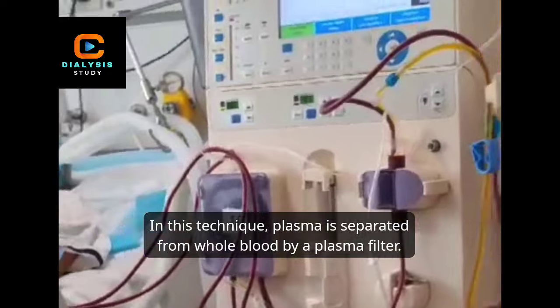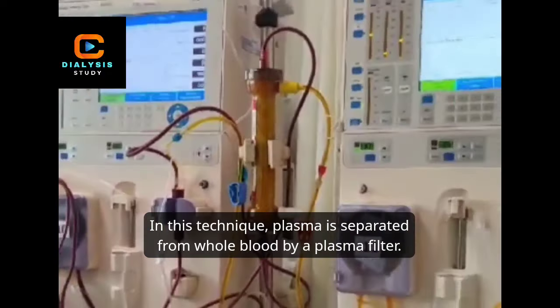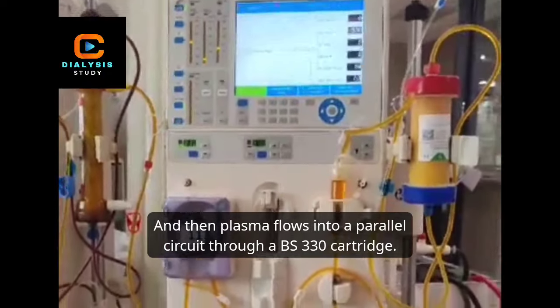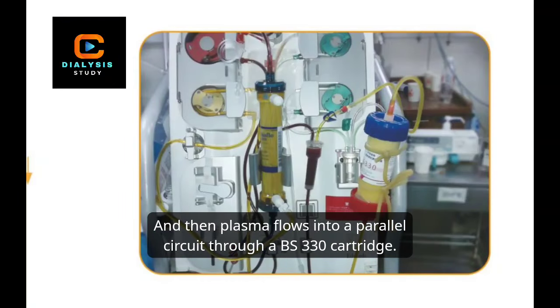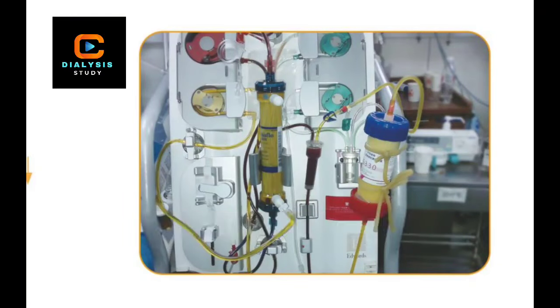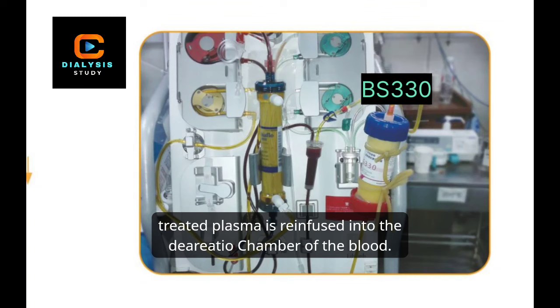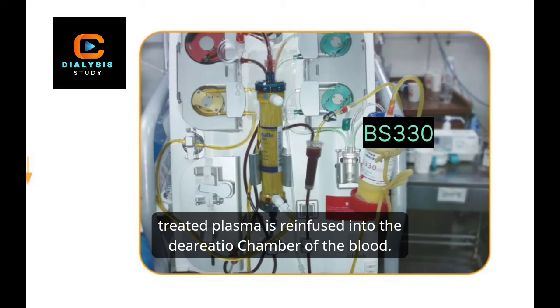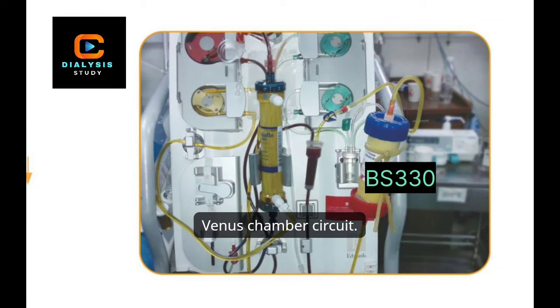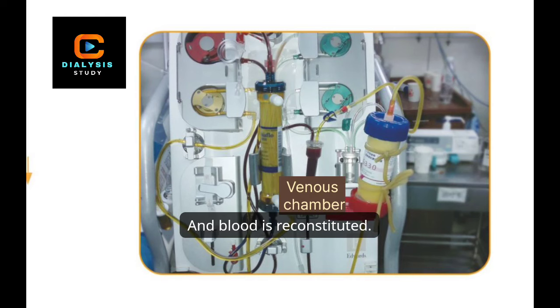In this technique, plasma is separated from whole blood by a plasma filter, and then plasma flows into a parallel circuit through a BS-330 cartridge. After passing through the cartridge, treated plasma is re-infused into the deaeration chamber of the blood venous chamber circuit, and blood is reconstituted.